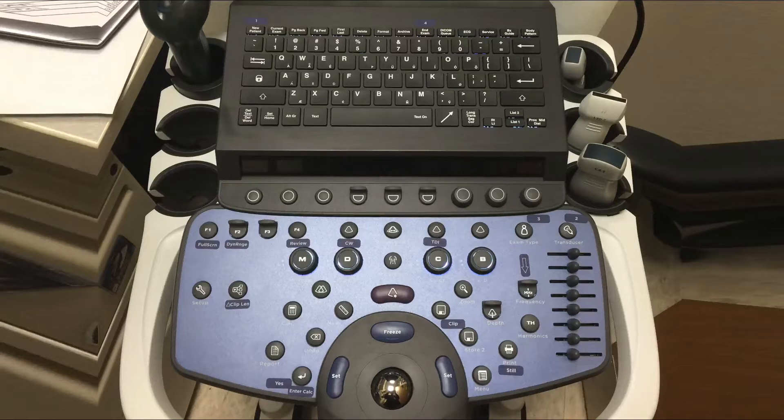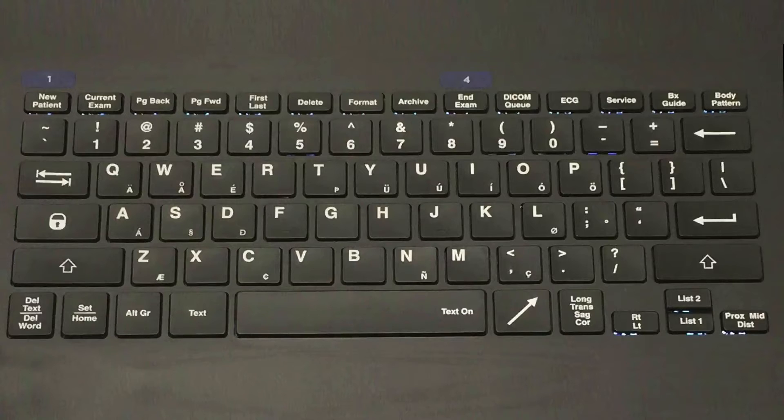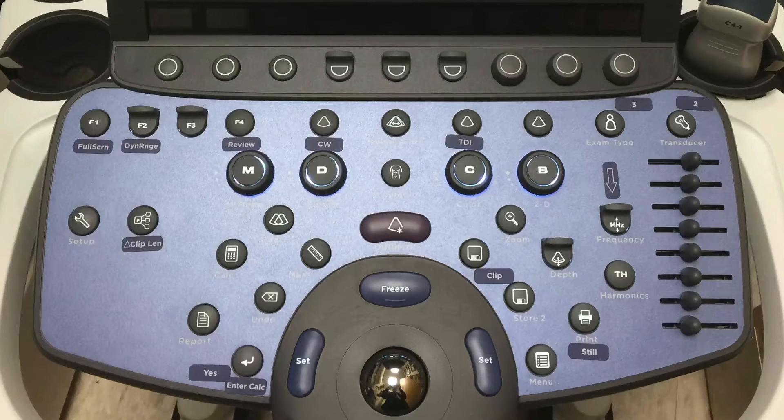This is the panel for the ultrasound system. It features a corded keyboard with function keys at the top, and this is the ultrasound interaction system. The display panel has a lot of buttons, but you only need to know a few of them. Some have stickers on them to highlight the important ones, but we'll go over the key buttons you need for basic functionality.